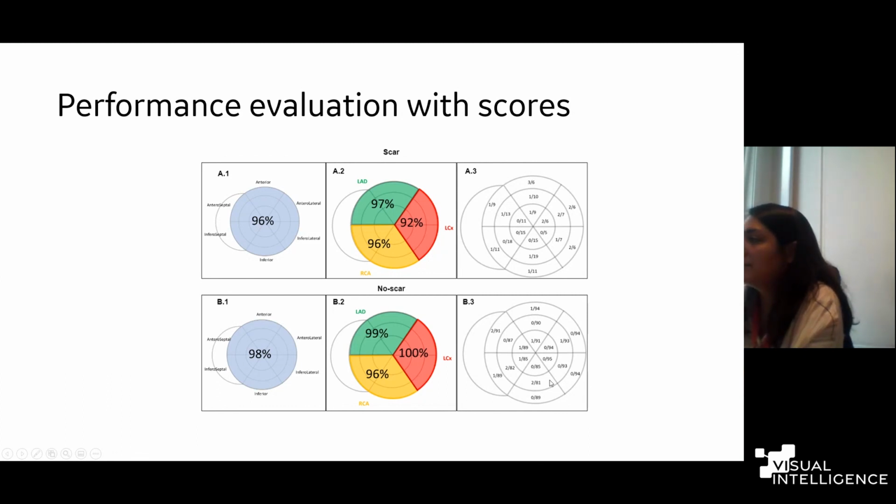On the right side, this is a different information representation, this rightmost column, because it shows the misclassifications. This is not related to accuracy, but it's the misclassifications for each of the left ventricle segments. So for this segment, I forgot the name of this particular region, basal something, 6 of them had scar and 94 of them had no scar, and 3 out of 6 were misclassified, while 1 out of 94 no scar were misclassified. So that's the way to read this map, and this is one way to show the audience the success of localization in more detail.